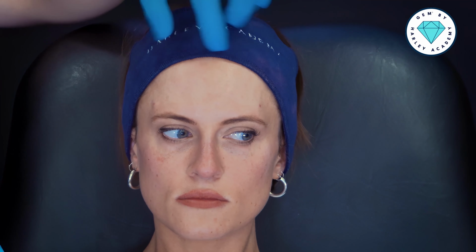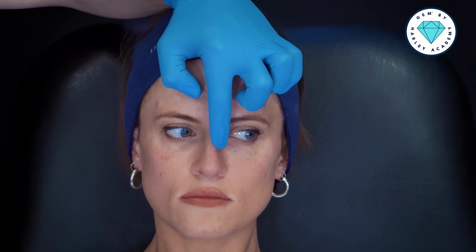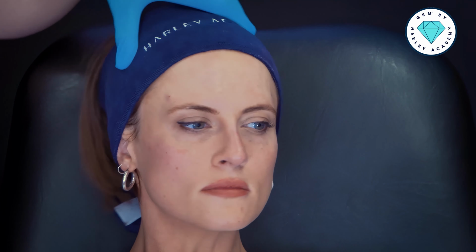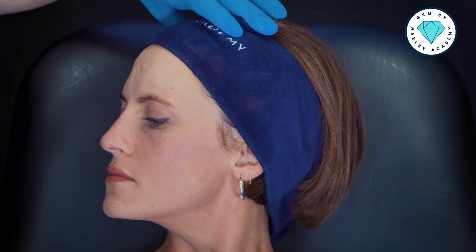So now if I sit you forwards, please, and look into the camera. I hope you can appreciate here a change to the position of the nose, the aesthetic lines going from the brows down to the tip. I turn the head face all the way this way. Very beautiful, straight dorsum of the nose. And all the way this way. All right, Claire? Mm-hmm. We're done.